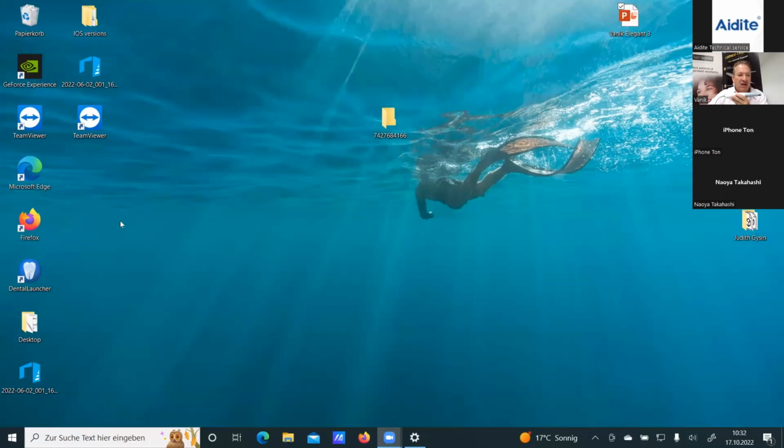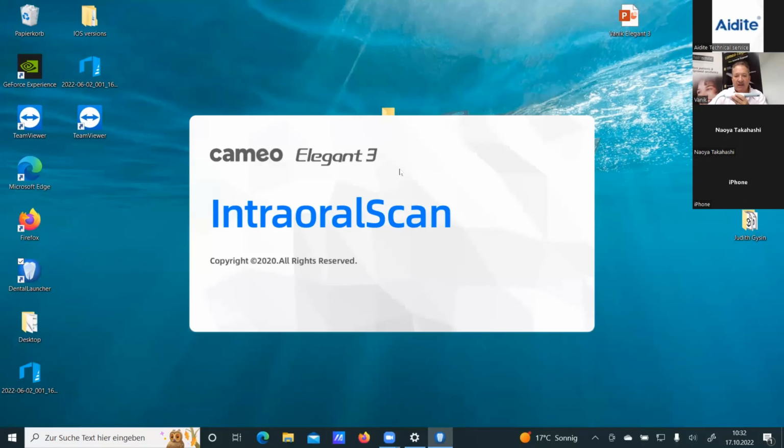Okay, doesn't matter. Here is the software down here, Dental Launcher. I double click on this. Do you see what's happening here on your screen? Yes, we can see. Okay, all right. Then here, this is the startup screen.